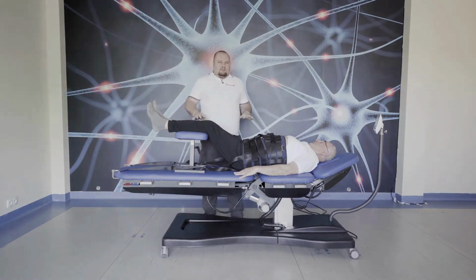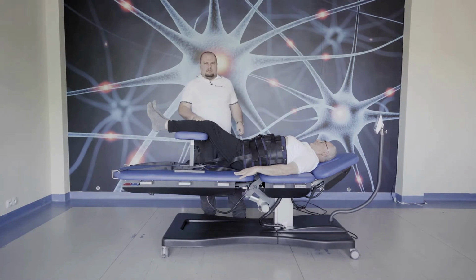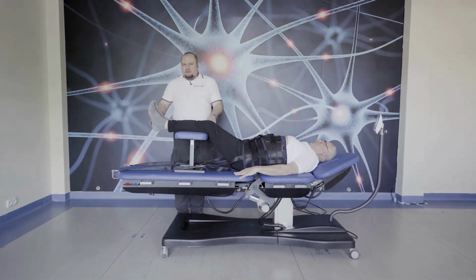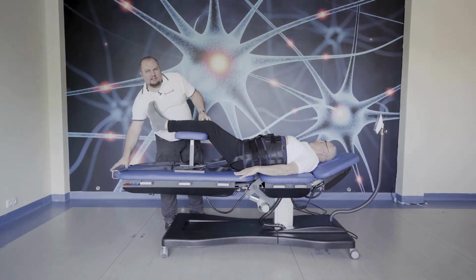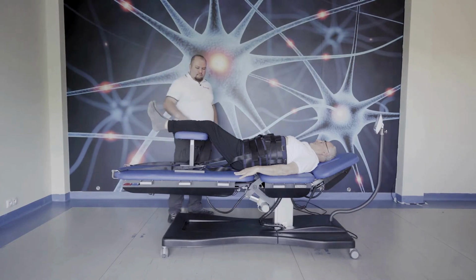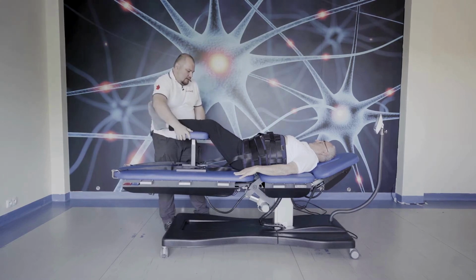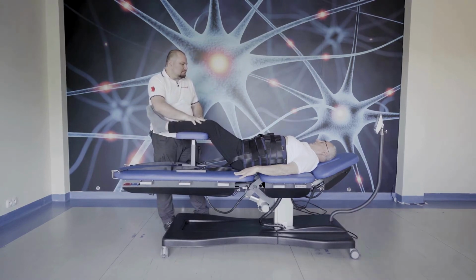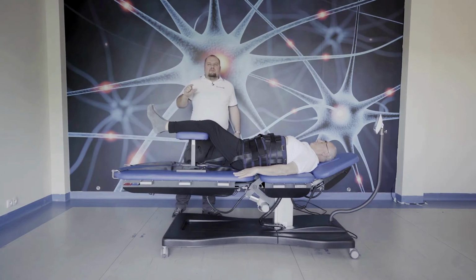The best position for the patient is when his lumbar spine is in a neutral position. We also may use the mechanical properties of the table and lift the mobile part a little higher. Is it comfortable? Yes. What is most important? The patient must be in a comfortable position without any pain.